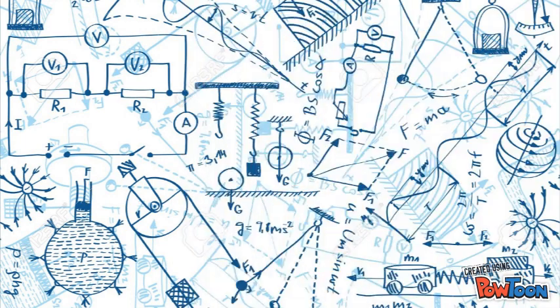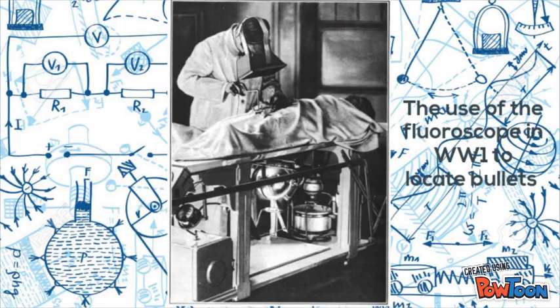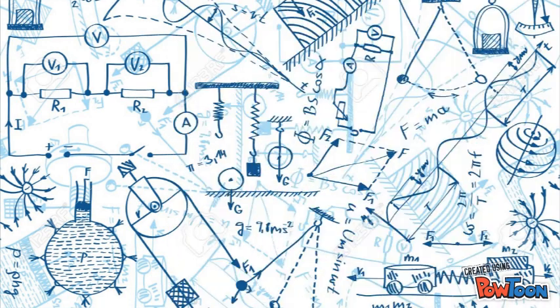Only 4 months later, Thomas Edison discovered that calcium tungstate produced a brighter image. This led him to create the fluoroscope. 2 months after the discovery of Edison's fluoroscope, the new invention was already in production and was used on the battlefield to locate battle wounds.